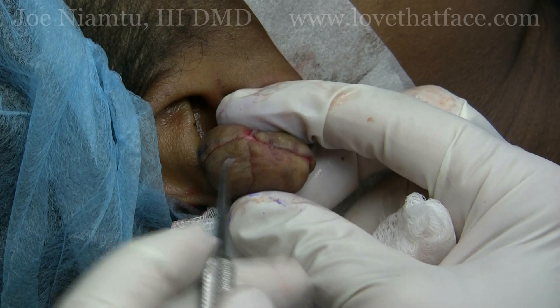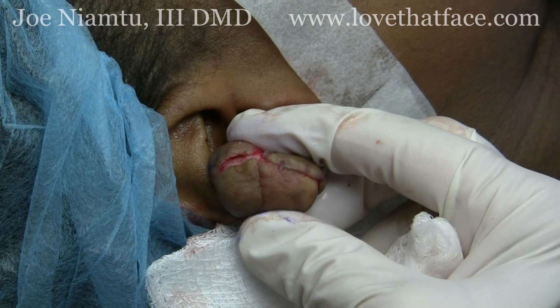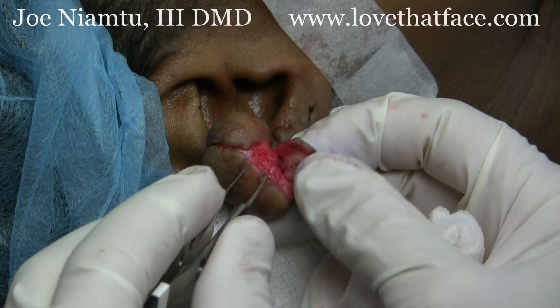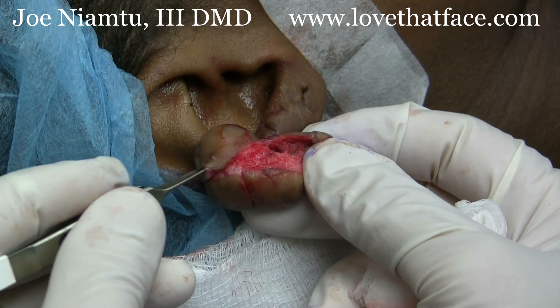We are treating this keloid an alternate way. This is a technique where we get under here and shell this out. The advantage of doing it this way — and we've pre-dissected this part of it — is that we can get the whole keloid out from the skin. Then we'll laser the bottom tissues.